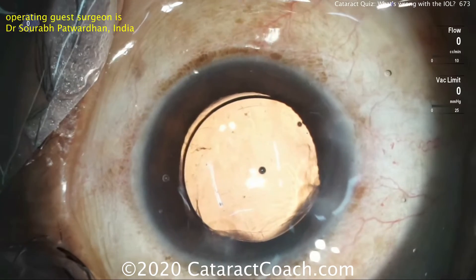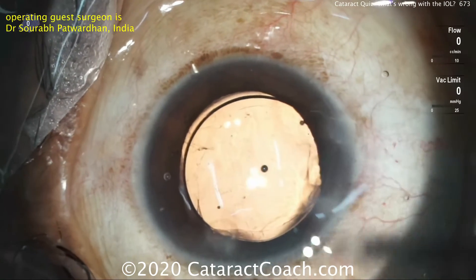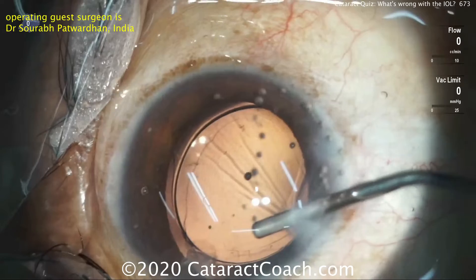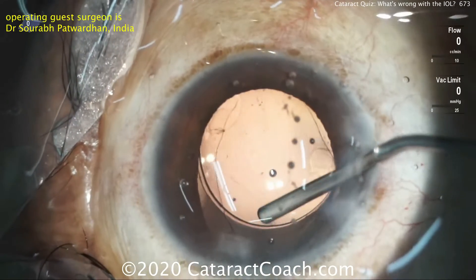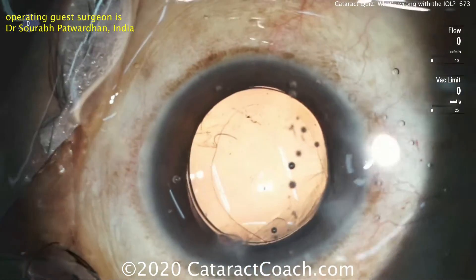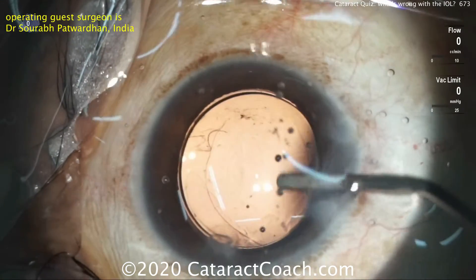No issues at all. Case looks great. And again, this small thing of putting the IOL upside down has to be addressed — it does change the optics. This lens in particular has a vault to it, and so you want the lens in the eye in the correct orientation.